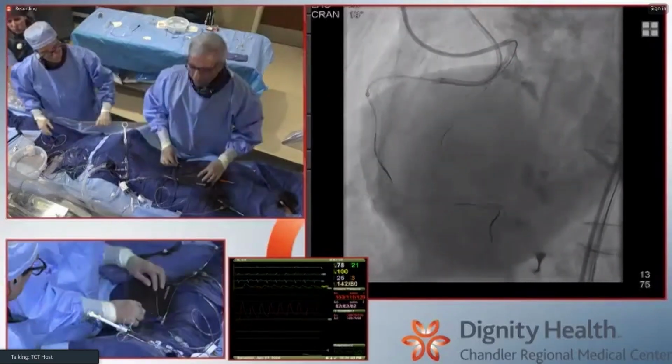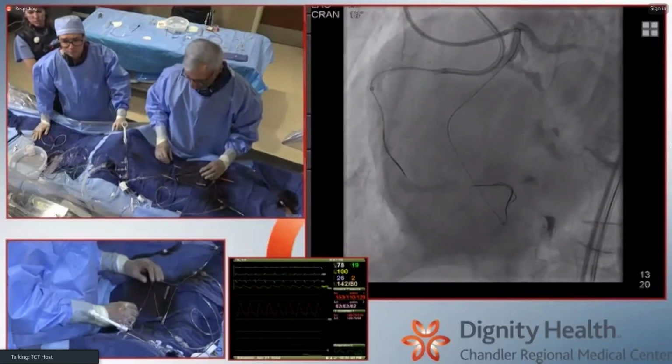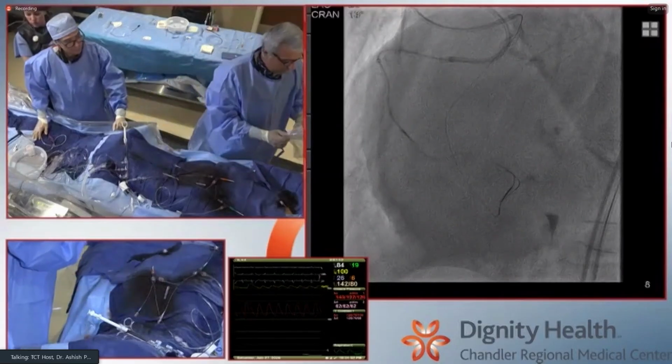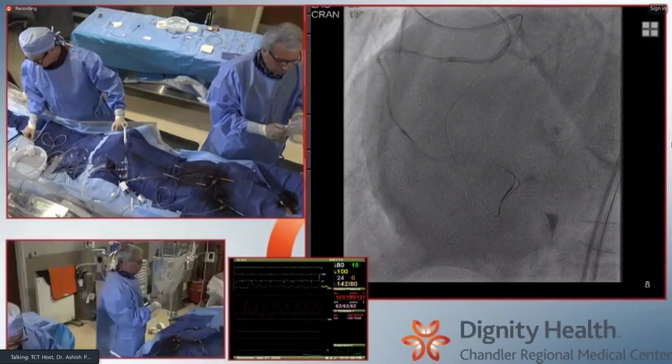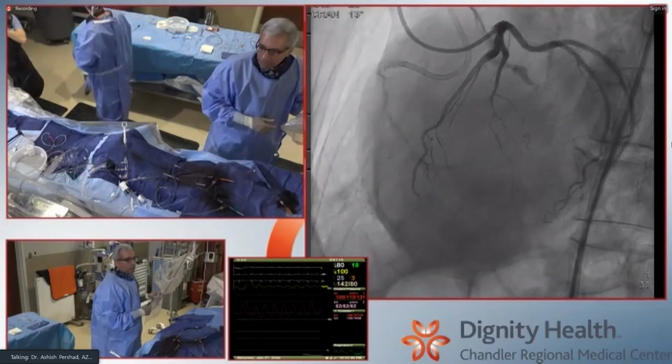I think I saw you enter a branch. So are you able to enter a couple of different branches off the PDA, just gently with that wire? Let me take a first shot and see how it looks though. Let me just go back and play this.